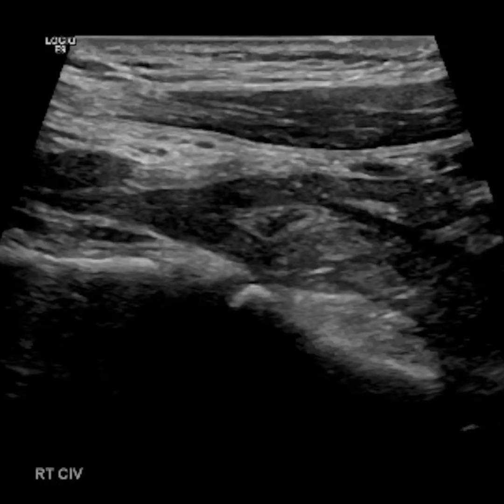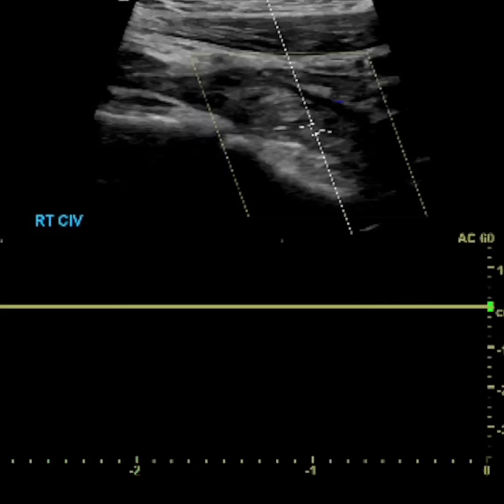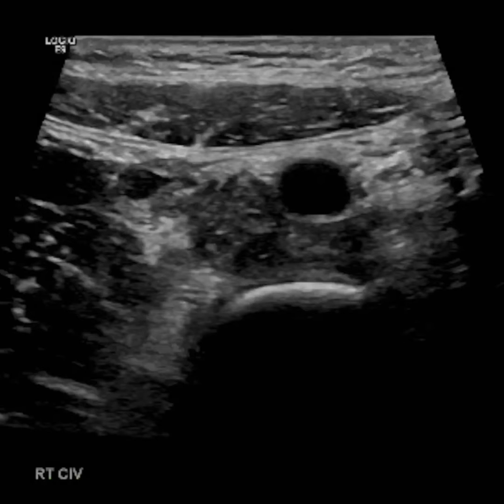Hey there sono peeps, Henry here. This is an adolescent patient that presented with spider veins and leg swelling, no other symptoms.